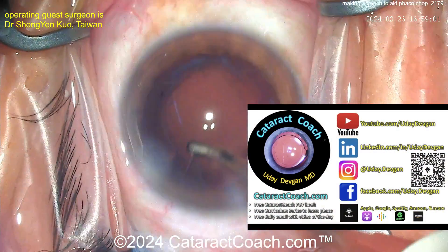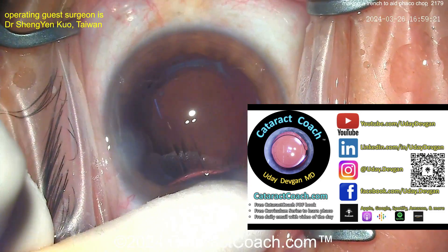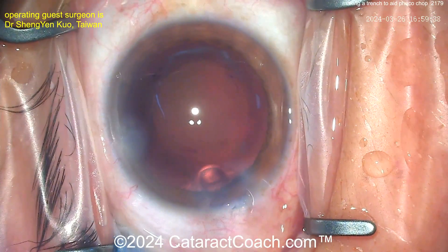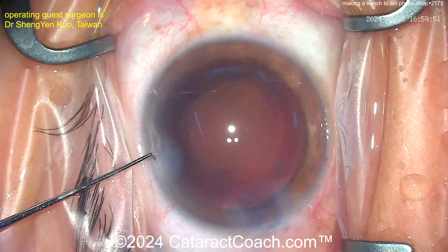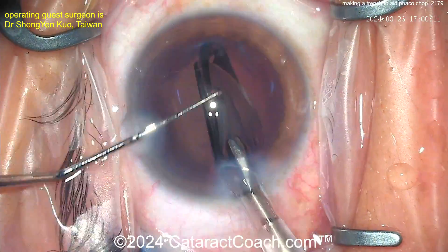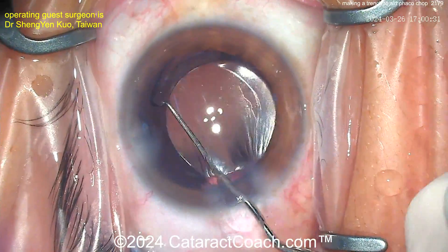Check out our teaching website CataractCoach.com — it's all free, especially the book. Now here we go: viscoelastic going in, filling up the capsular bag. There's a little bit of staining of the capsule — that can happen with really opaque, dense cataracts. The lens is a single-piece acrylic IOL going into the capsular bag nice and easy, delivered in to finish up the case.